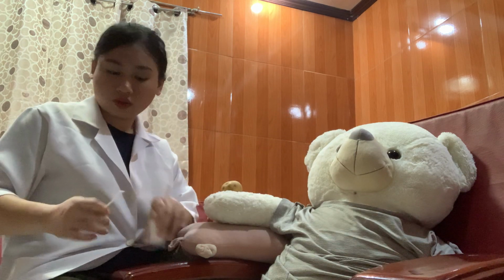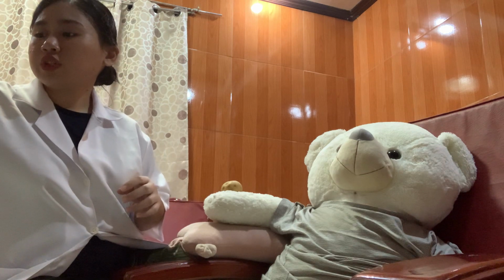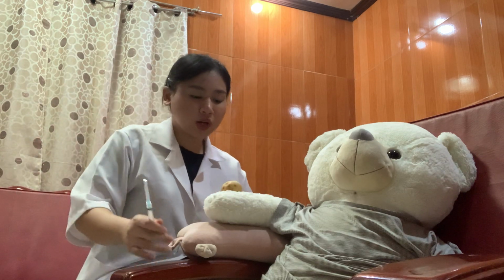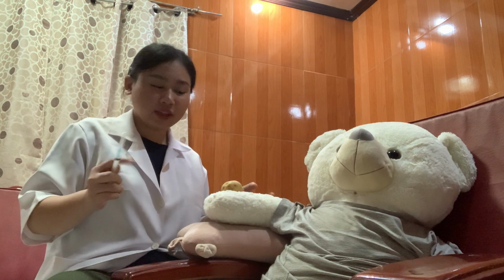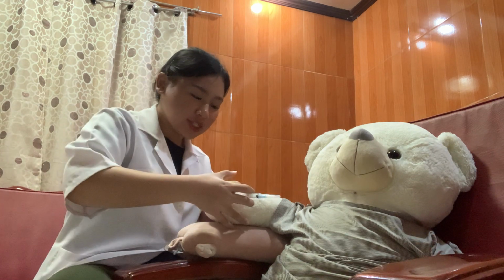After we dry the site, we perform the percutaneous puncture of the selected site. Now we first locate the artery.